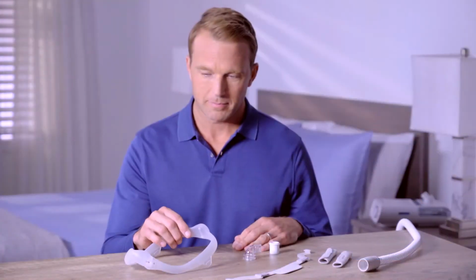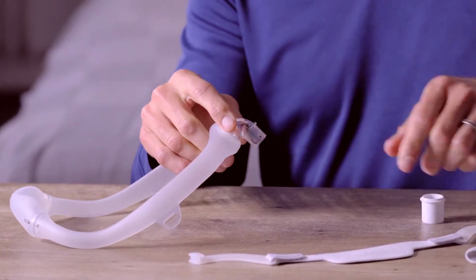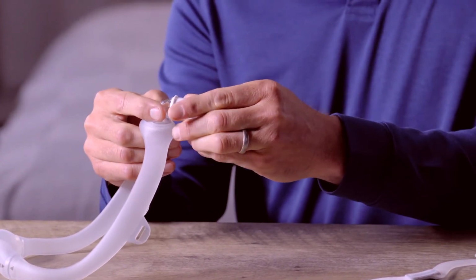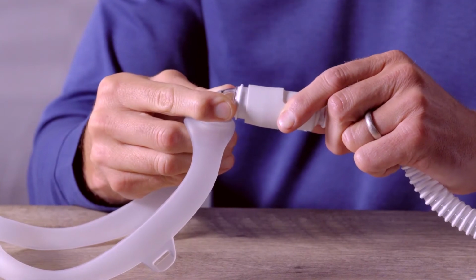Whether you're using gel pillows or an under-the-nose nasal cushion, insert the elbow into the mask frame. Push the tubing quick release into the elbow. The quick release lets you easily disconnect the tube, which is helpful if you get up to use the bathroom during the night.